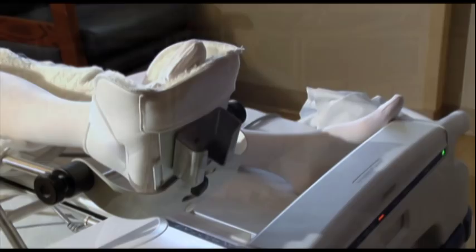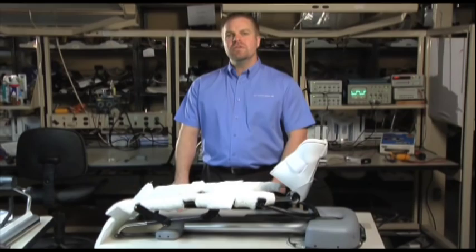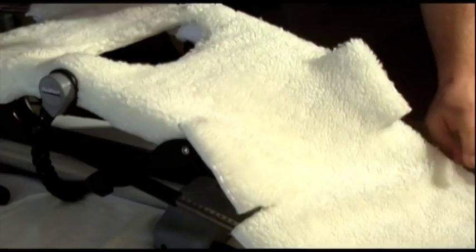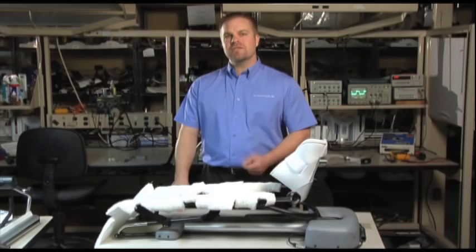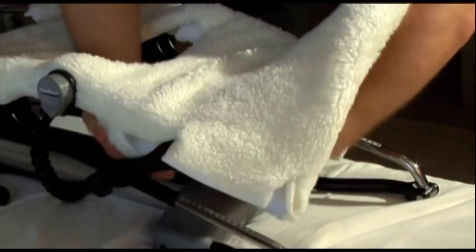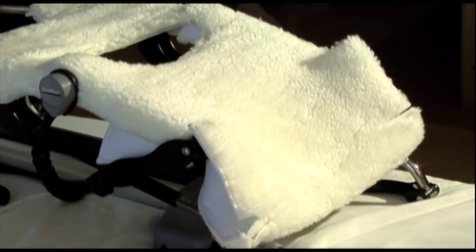Pad kit application is a major component in patient comfort. Please refer to the MedCom Group's website to watch a short video on proper pad kit installation. You may also request a complimentary DVD for your facility. Due to the variety of CPM machines available on the market, the MedCom Group, working closely with physical therapists, has developed a comfortable, standardized CPM pad kit that fits all conventional CPM machines being manufactured today.